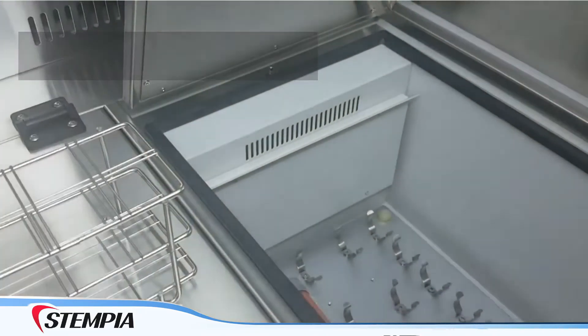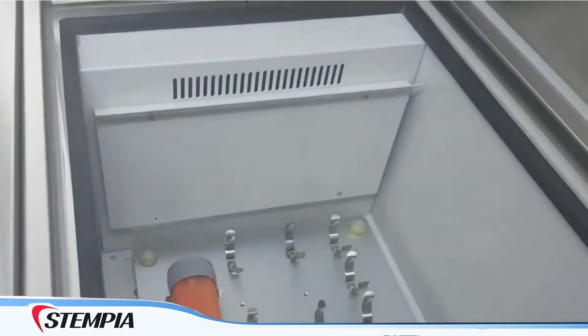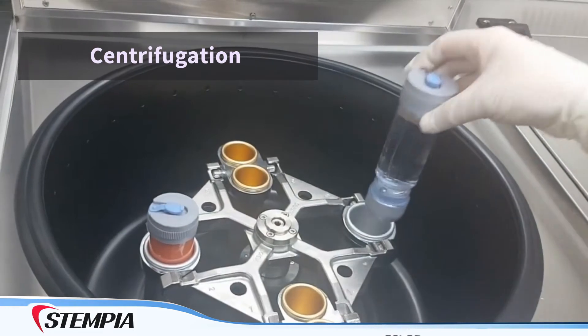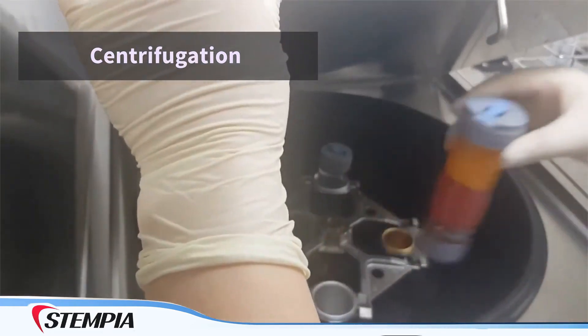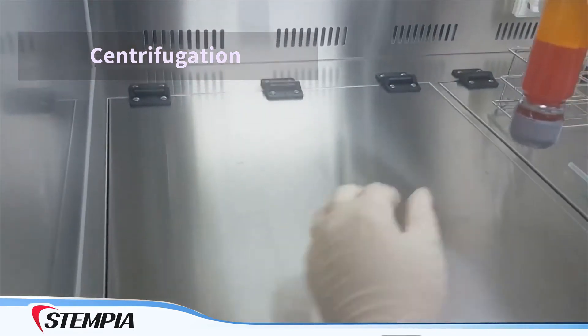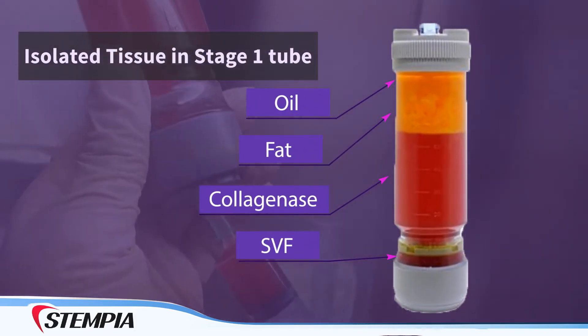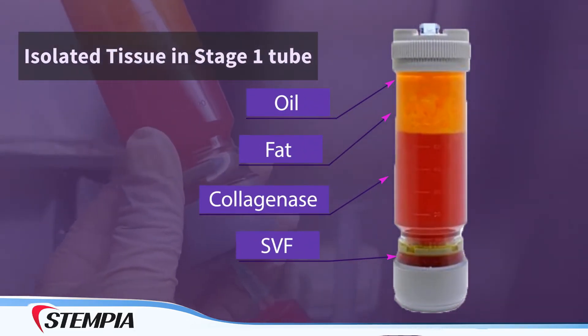After the incubation process, adipose tissue stem cells are then placed into a centrifuge and spun. This process gently separates the fat from the stem cells. Here you can see the stem cells in purple have separated and are at the bottom of the test tube.